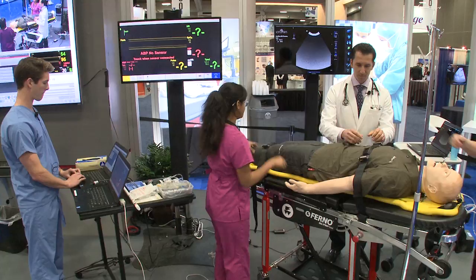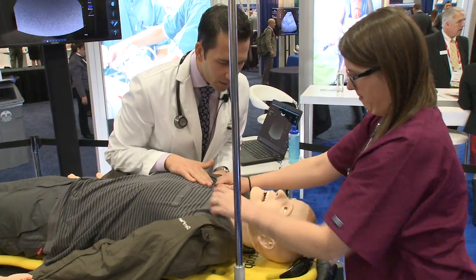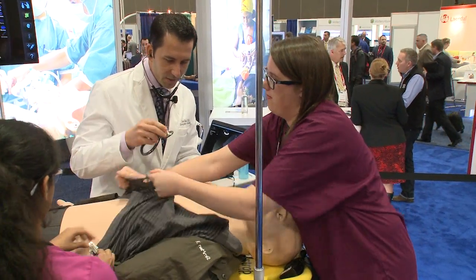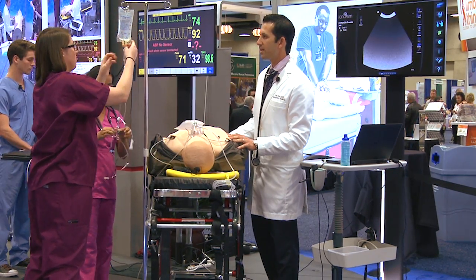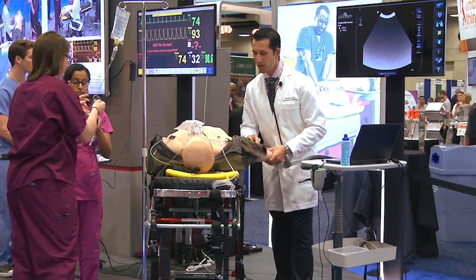We did a case of a man who has fallen off the second story of a building. He comes into a trauma center altered, having difficulty breathing, with bruising to his right chest wall, and we're trying to figure out why his blood pressure is so low. We start him on oxygen, place an IV, and go through our trauma assessment as we would in real life, which includes focused abdominal sonography in trauma — the FAST protocol.